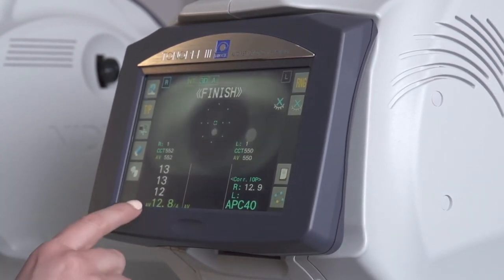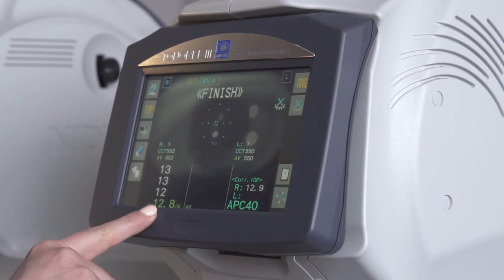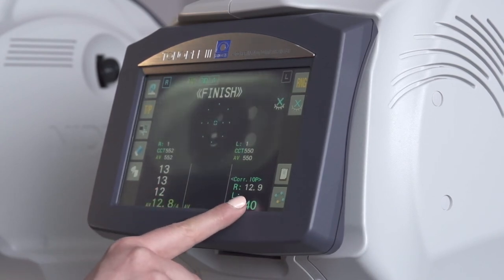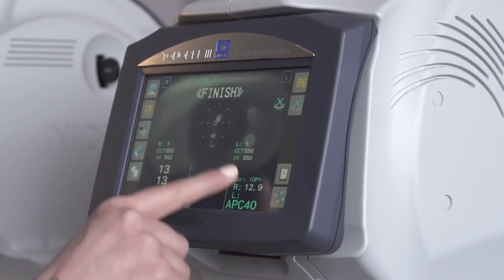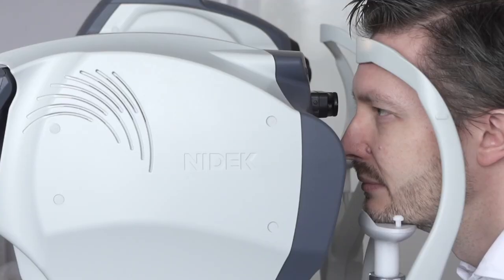The measurements are finished now, and we can see on the screen we've got our average tonometry reading and our corrected intraocular pressure based on our central corneal thickness in our pachymetry measurement.